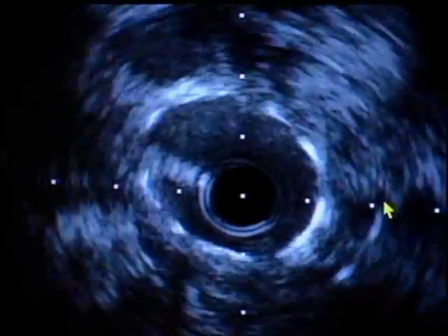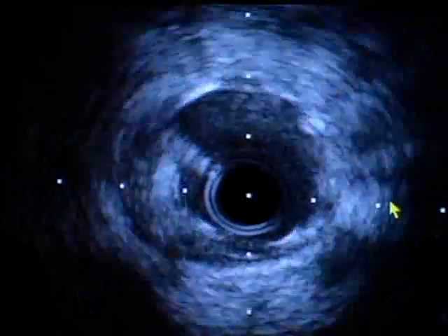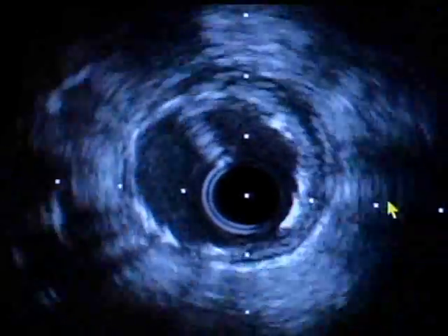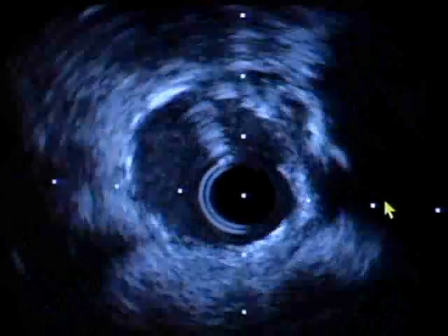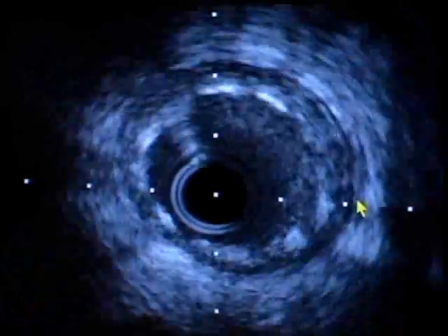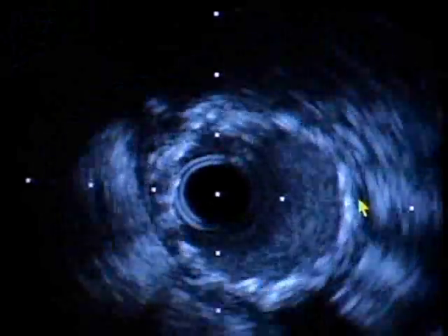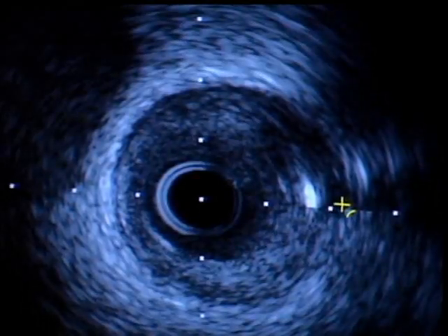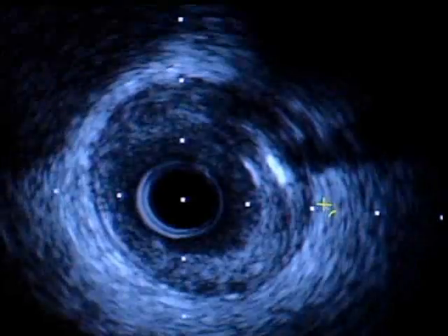Now, this is the stent. Is the stent well expanded? No dissection there. This area, definitely, we need to expand the stent a little bit more. We could take a 3.0, 20 NC Voyager, please. Yeah, this area. Go one block, a little back, slightly back. Yeah, good.